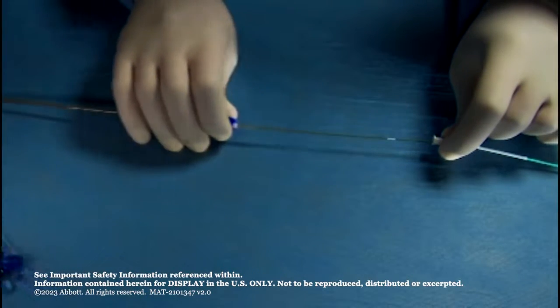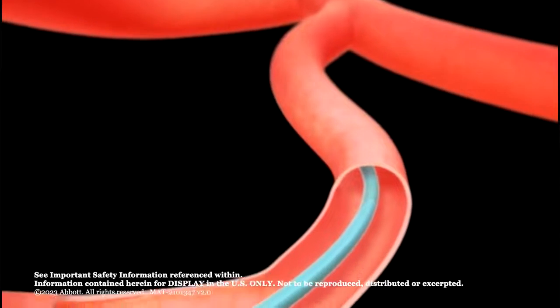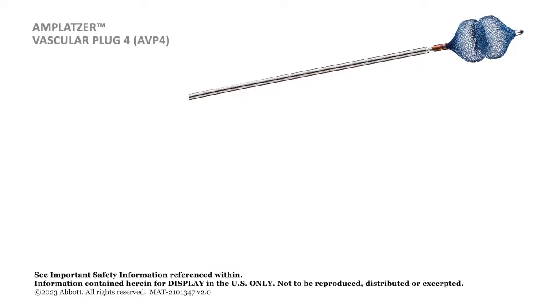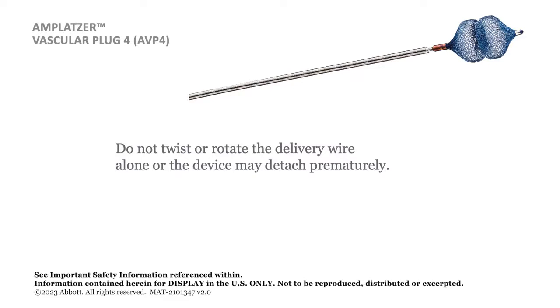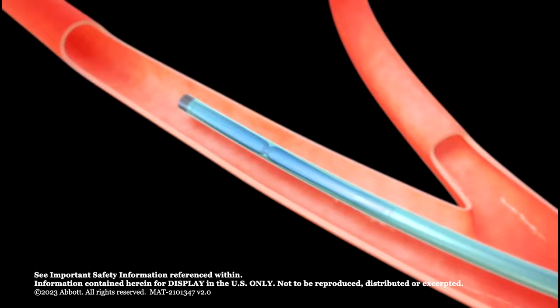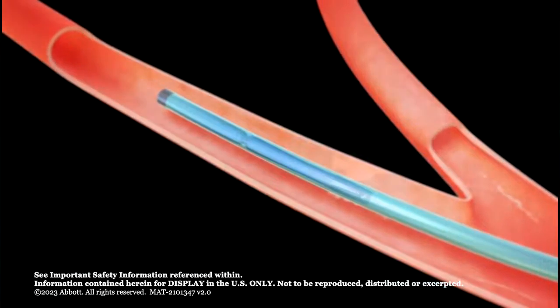Remove the loader if desired. Advance the Amplatzer Vascular Plug 4 up to the diagnostic catheter distal tip. Do not twist or rotate the delivery wire during advancement. If rotation is required, rotate the diagnostic catheter along with the delivery wire. Adjust the diagnostic catheter position if required to ensure the distal end of the device will deploy at the distal edge of the occlusion site.